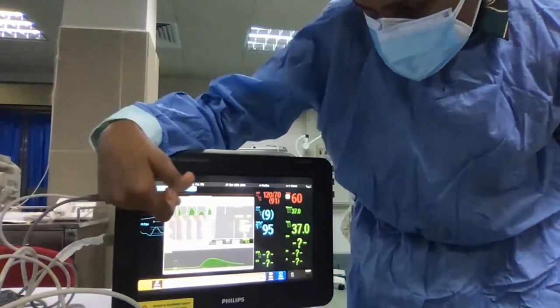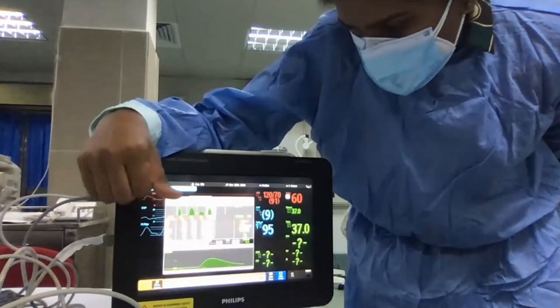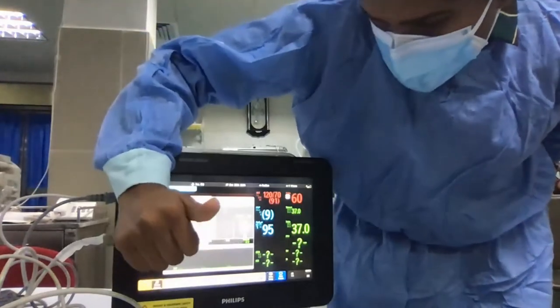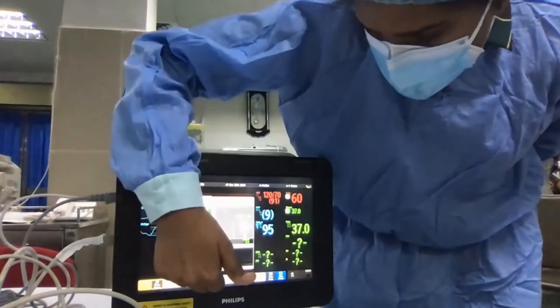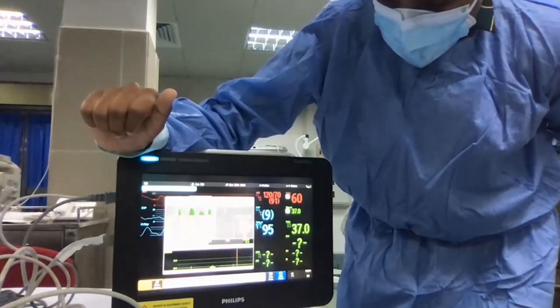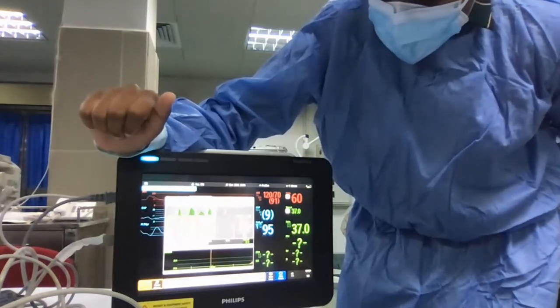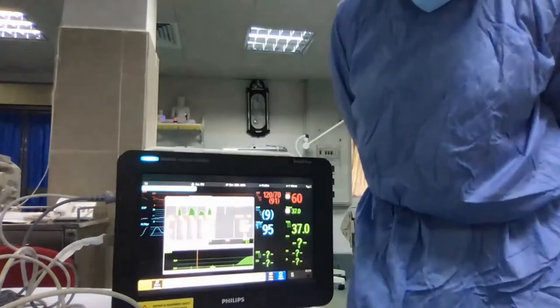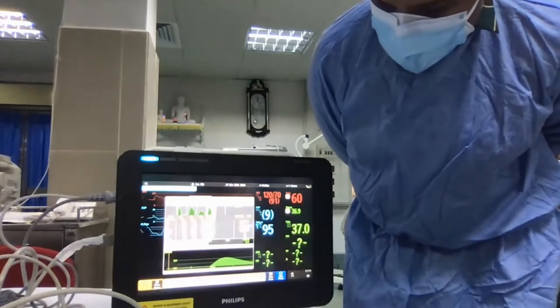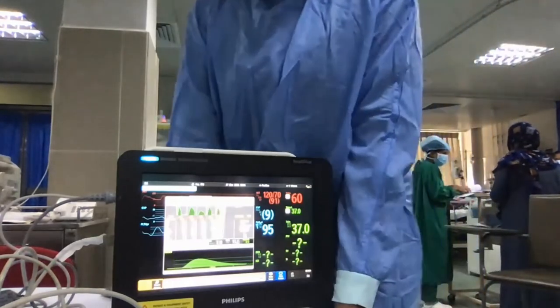Wait before starting the measurements. I will take one more measurement. Okay, ready for new measurement. Start cardiac output. Stable baseline, inject now. That looks a little better. Yeah, that graph looks a little better.